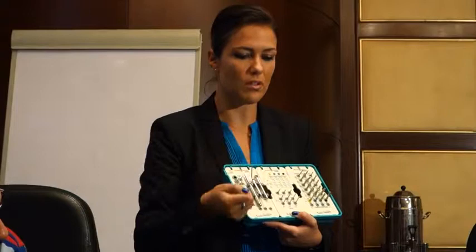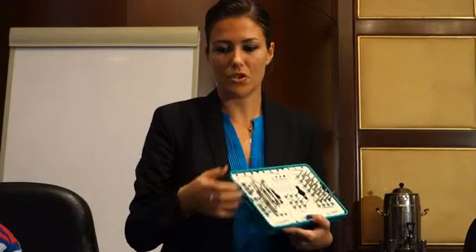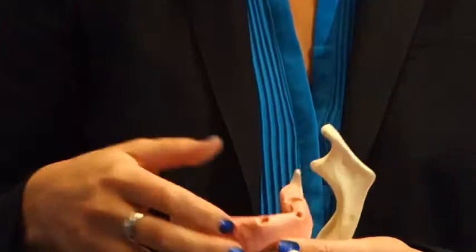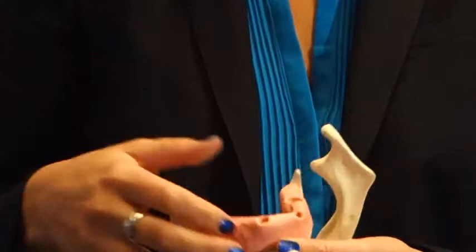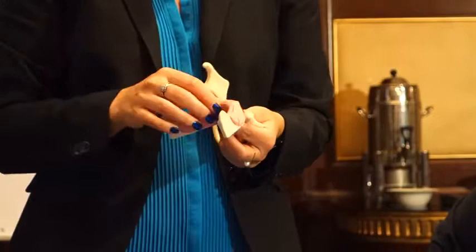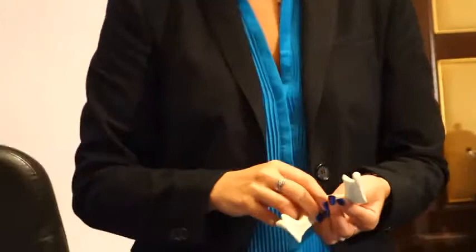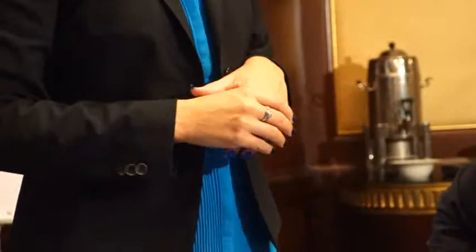You can choose to practice on this mandible or use the alveolus model. Immediate placement after extraction is more complicated — those experienced with it will find it easy, others should use the practice mandible. You can place one, two, three, or more implants, and there are plenty of models to practice with. We also have models for immediate loading to demonstrate afterward.